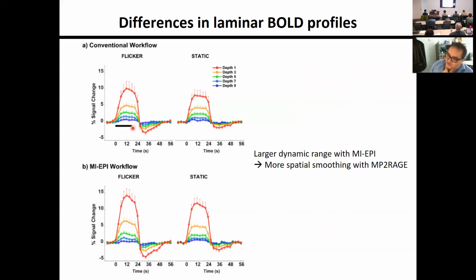And the way I interpret it is, if we have registration errors and mislabeling of the layers, essentially this corresponds to a smoothing operator. Let's say we have layer 2 in reality, but due to segmentation and registration error, it was assigned on average to layer 2, but sometimes to layer 3, and sometimes layer 1, which is a smoothing operation.